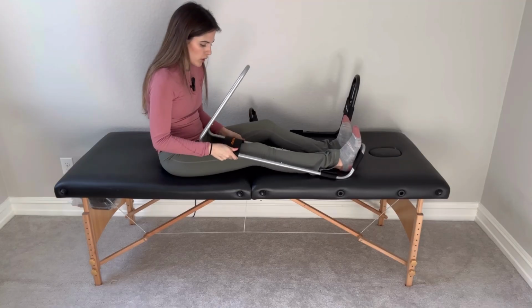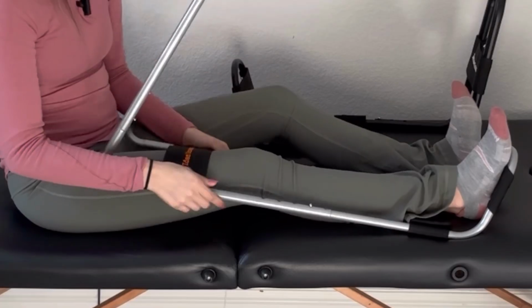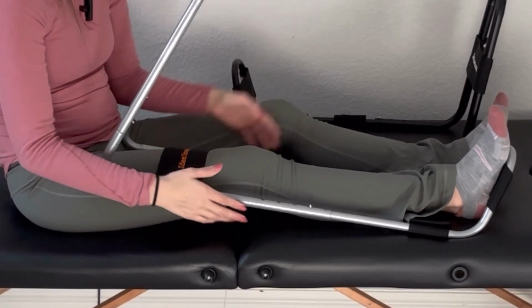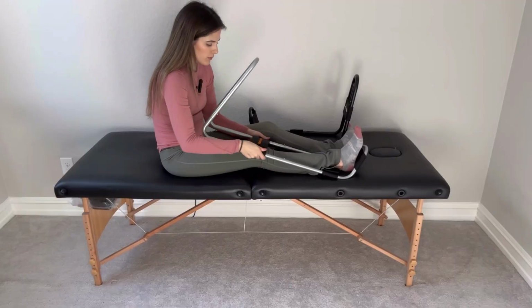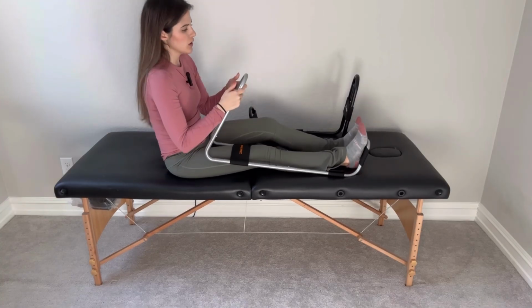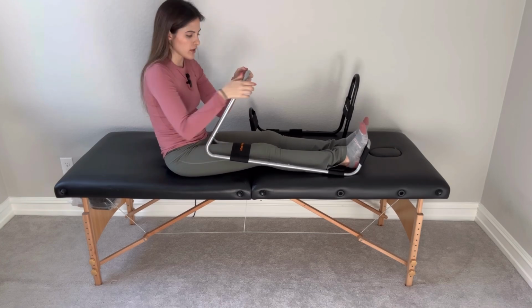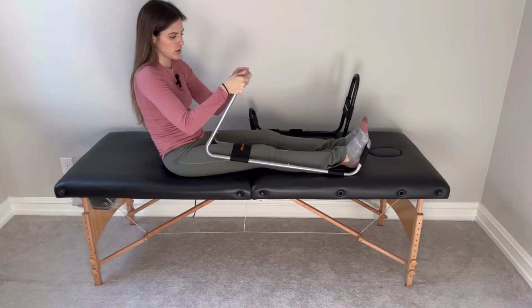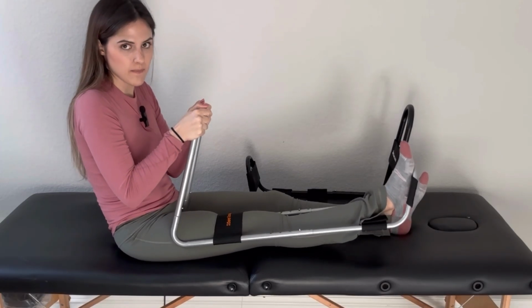So you want to get the strap as close to the knee joint as possible. I generally recommend this strap goes above the knee. That is the most beneficial place to put it, but it is allowed below the knee as well. But I'm going to demonstrate it at the top of the knee. So you're here in this position. You can either do this stretch upright, just like this, or you can lay back. So all we're going to do here is you're going to be pulling with your hands towards you, just like this, and you will feel a stretch in the back of the knee.